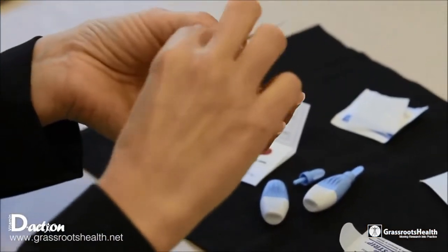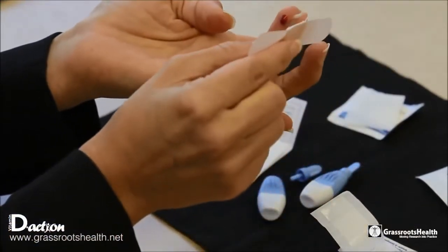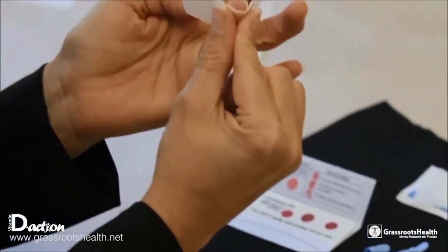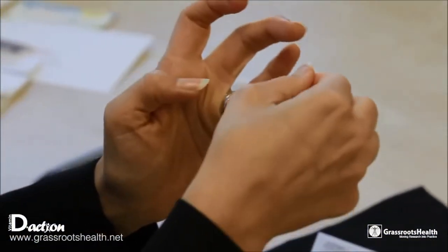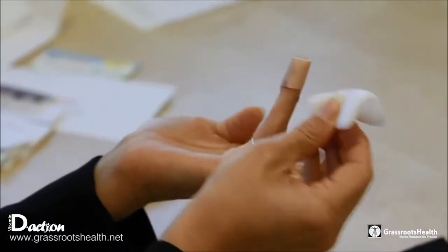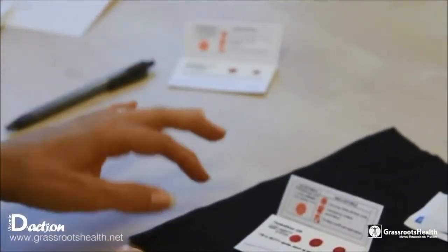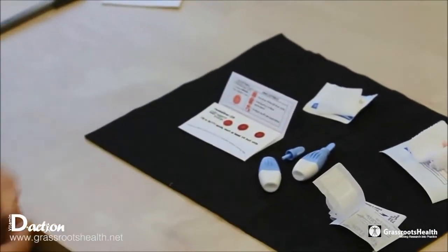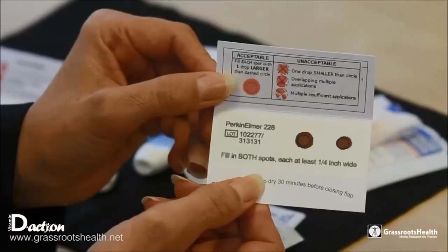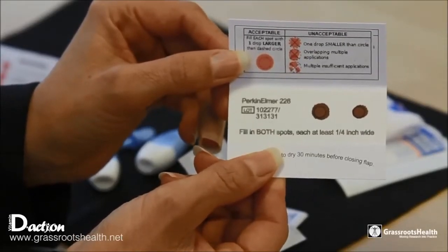Now we can apply the band-aid to your finger, which you can wear for 30 minutes or an hour, or however long you wish, just to keep the blood from flowing. Once you have done all this, the next step will be to set your blood spot card aside and let it dry for approximately 30 minutes. Once it is dried, take a look at it — at that point it should be somewhat brown.